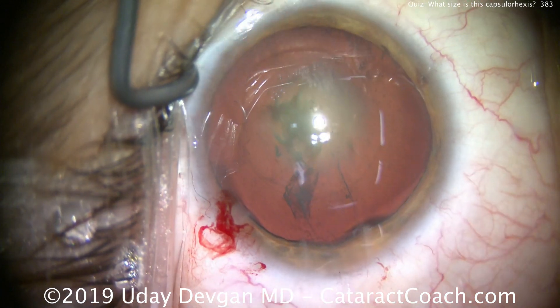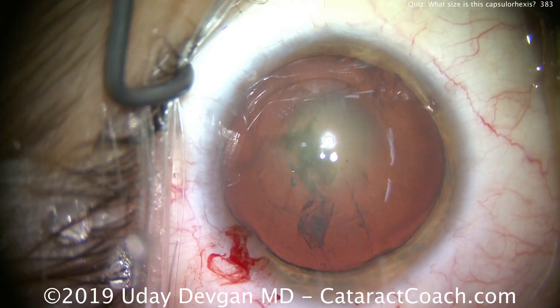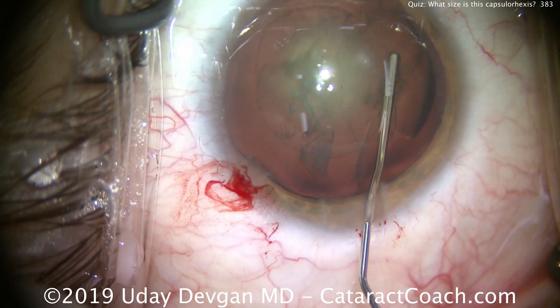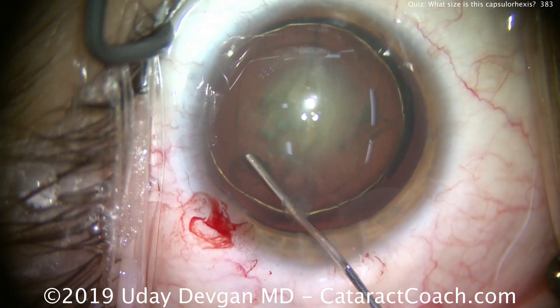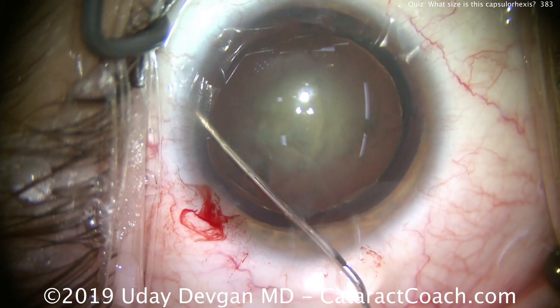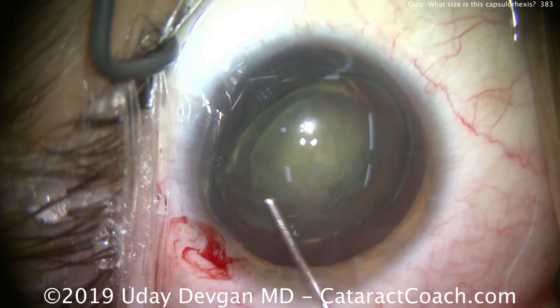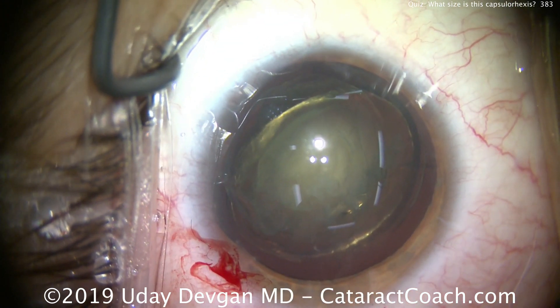For reference, we're aiming to make about a 5.5 millimeter capsulorhexis. The lens optic is going to be 6 millimeters, so we don't want it to be bigger than that. Four millimeters would be too small. There's the lens nucleus.